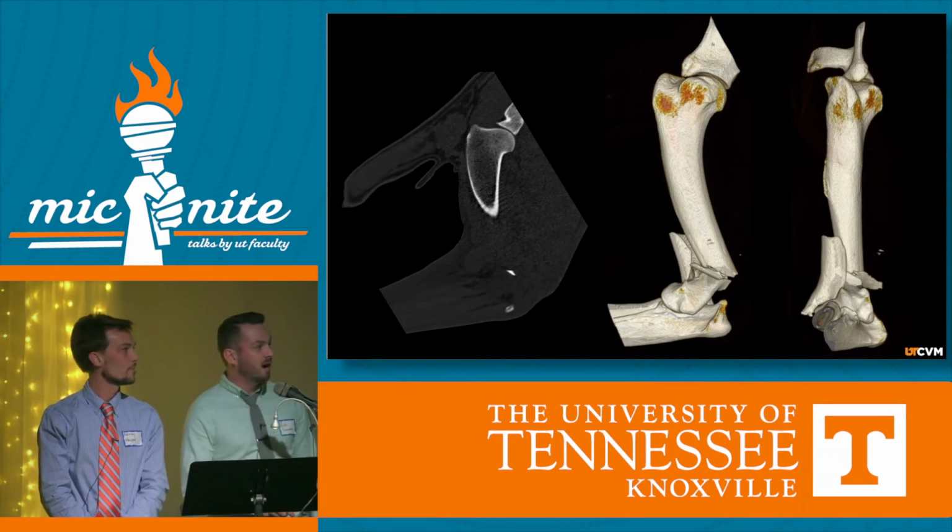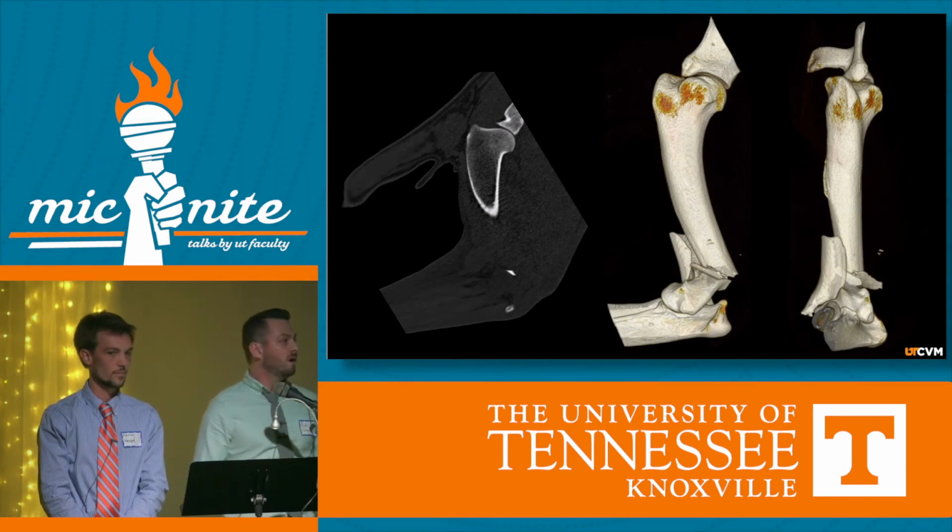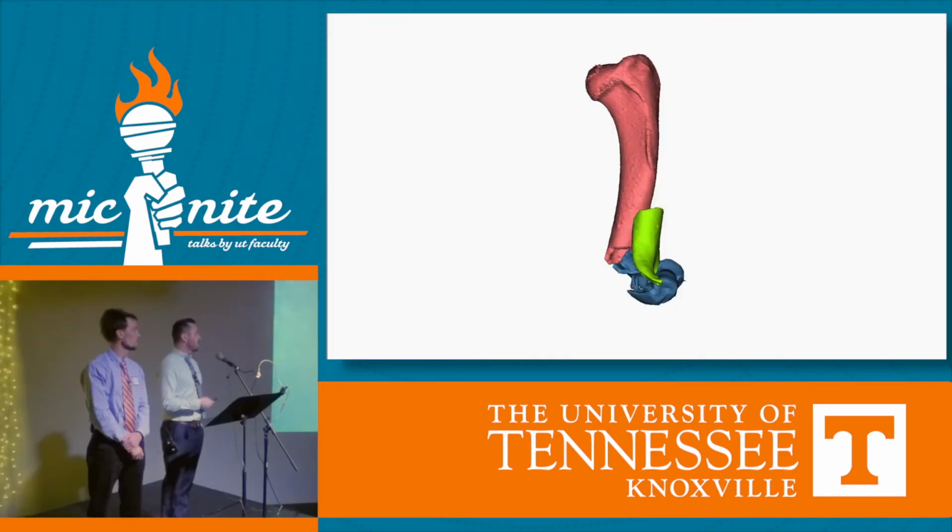So these are great. As a surgeon, I can now start to visualize how I'm going to repair this in the operating room. But I still don't know exactly where each little fragment's going to go. And so for me, where my interests are is I want to do a little bit better. So here, this is supposed to rotate, but it's not. But what we can actually do is take this in the same computer modeling software that we used on the turtle, and I'm going to individually kind of color, just like a coloring book, each little fracture segment, until I can move them individually.